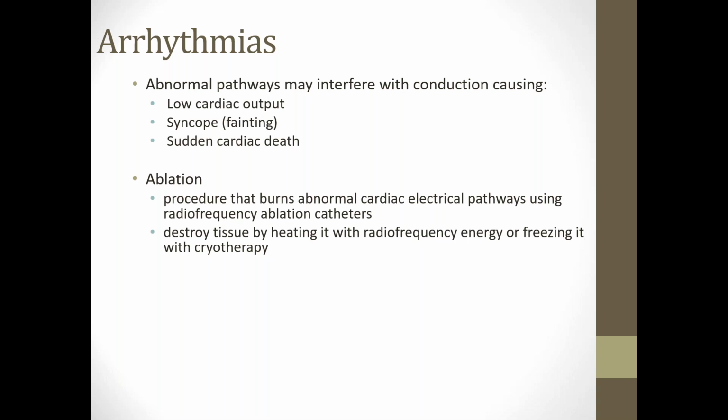Back when I got into it, they had to use 4 catheters that they floated up inside the patient to map these things. As the end of my time working on the biomed side of the EP equipment, one of the cardiologists was telling me that they had developed it where they could use a single catheter, drop it into the heart, and map the whole heart with one catheter. That's just a huge advancement in technology. So that's how they decide where they need to do the ablation. If they see weakness in the signal, or if it's crossing over into other places where it shouldn't, then they'll use the ablation.